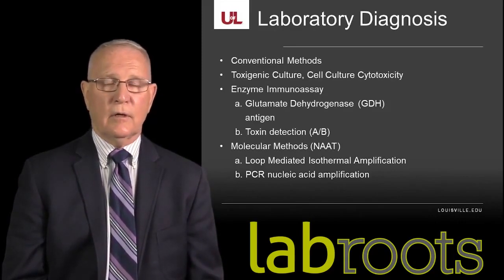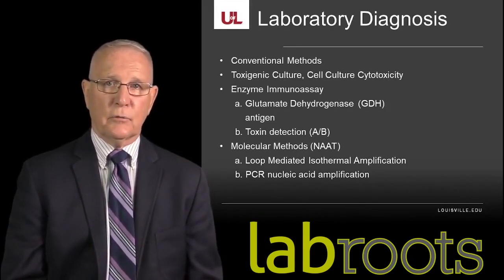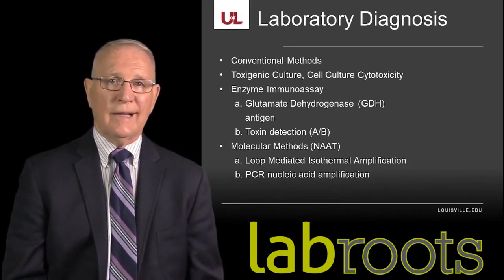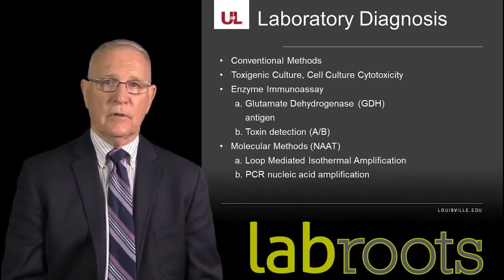Both the toxigenic culture and the cytotoxicity assay are regarded as gold standards when evaluating technologies designed to detect Clostridium difficile.